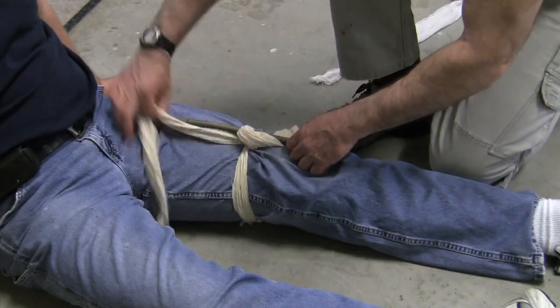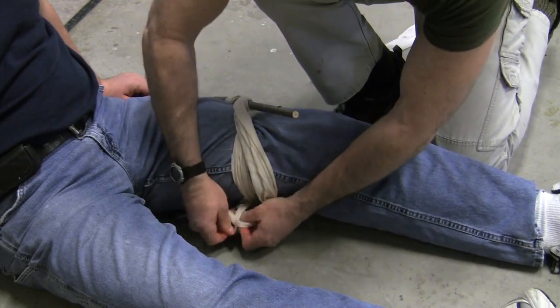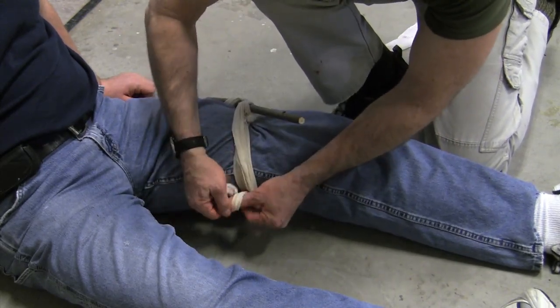As an alternative to the securing device, you may be able to use the strap to secure the windlass. Simply wrap the material around one end of the windlass and back around the extremity, and then tie one more knot in the strap, therefore securing the windlass in place.